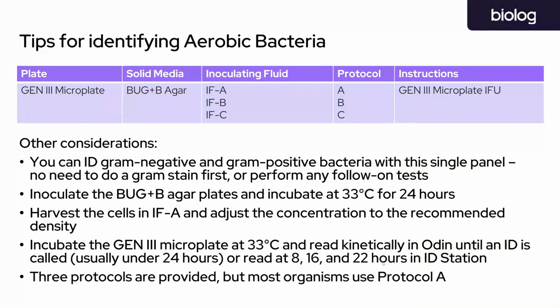And then if you are using one of our endpoint read systems like the ID station, instead of using Odin, you can take reads at various time points. Here we have suggested doing 8, 16, and 22 hours, but just doing the 22-hour time point is often acceptable, and you don't need to worry about getting those earlier time points.